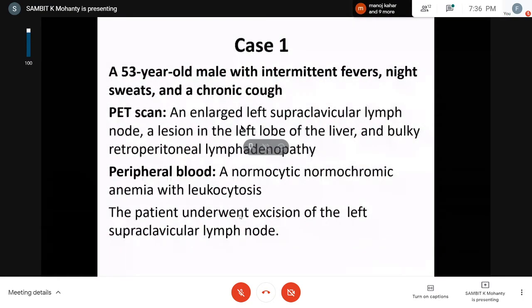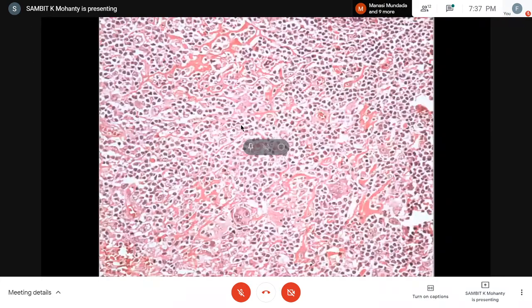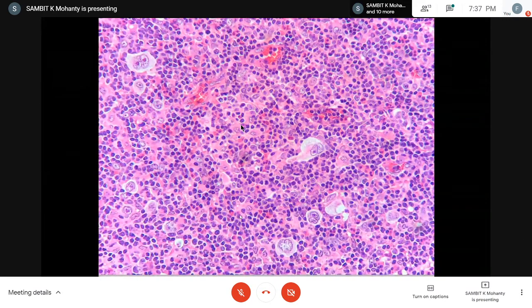So I'll show you another case with a similar kind of history. That was a 15-year-old male, and in that case it was not difficult. I did a CD45 (LCA) and a PAX5 to begin with. My CD45 was dead negative in those big cells, and the background cells are CD45 positive. The B cells in the background are strongly PAX5 positive, whereas these large cells are weak and barely perceptible, a very wishy-washy, weak PAX5 positive. So that basically helped me.